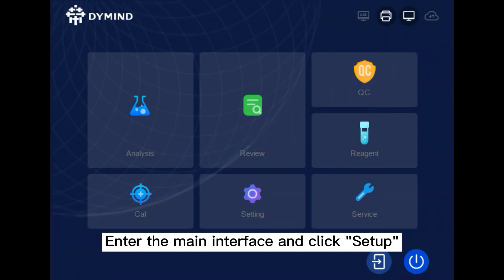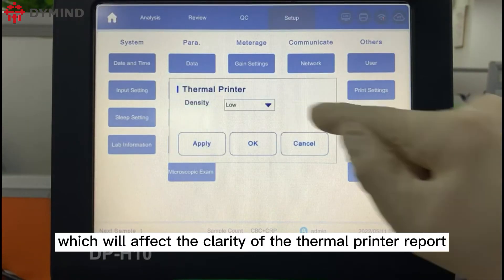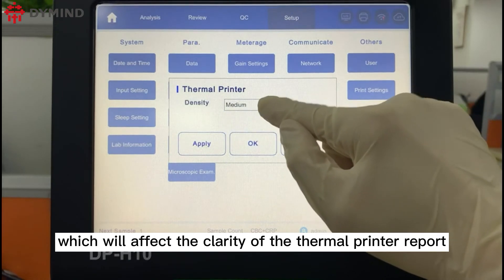Enter the main interface and click Setup, then Thermal Printer, to adjust the density, which will affect the clarity of the thermal printer report.